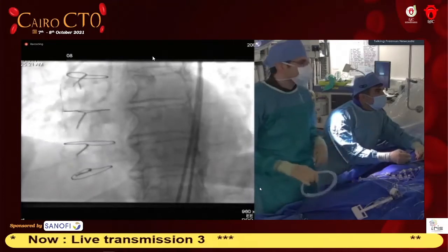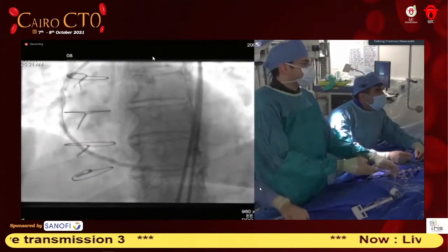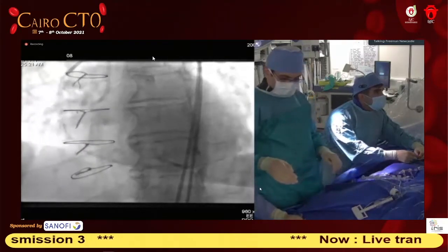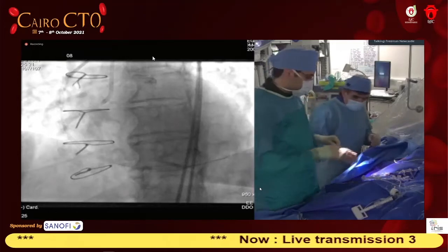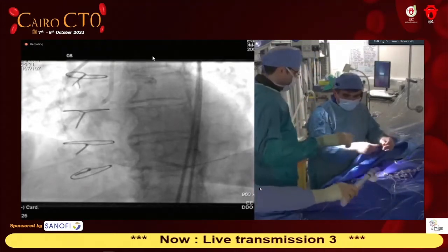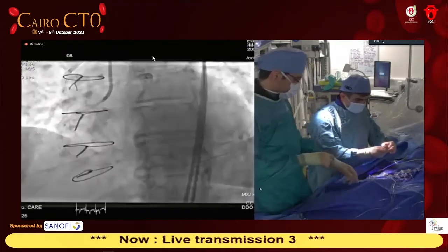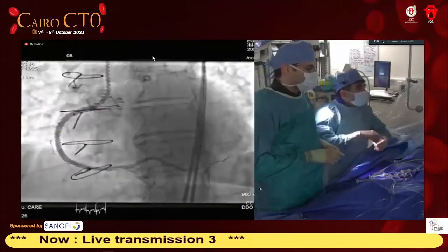It's going out of test there. Is that test on the retrograde? Okay, here we go. That's fine. Okay, just preempting. All right. Is that the stent? Okay. Let's go back one for me, David. Good.